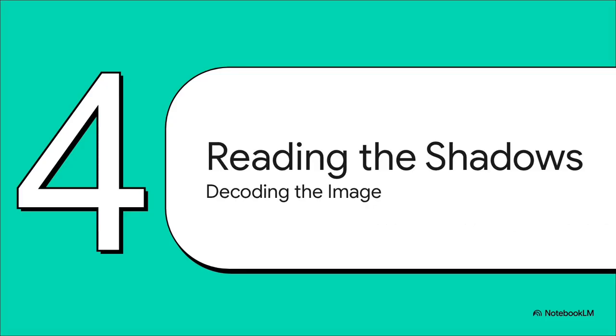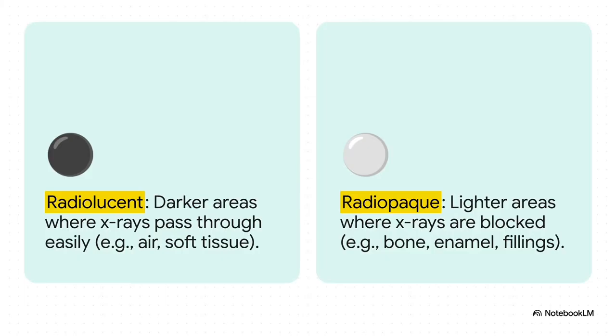All right, the scan is done. You're left with this image of black, white, and gray shadows. So how does a dentist actually read this map and turn those shadows into a real diagnosis? Let's learn the two most important words in the radiology world.